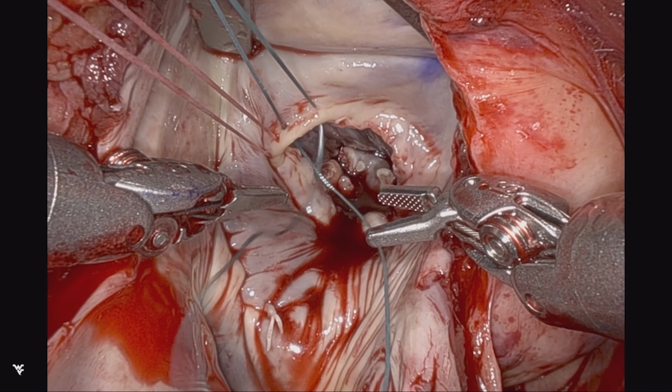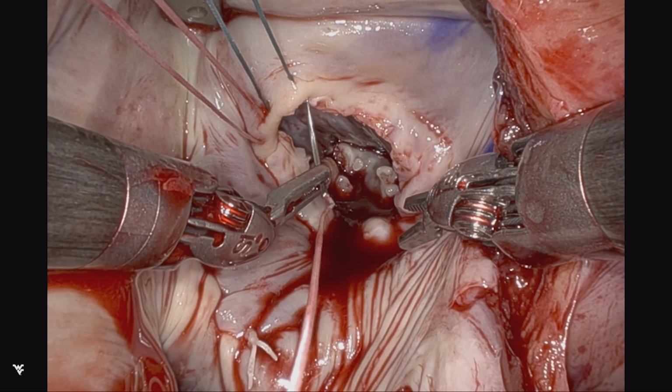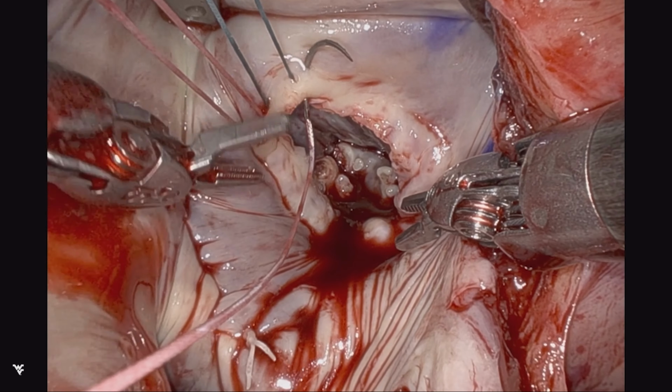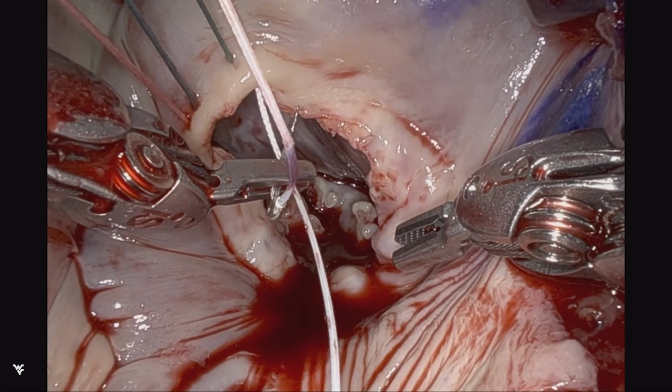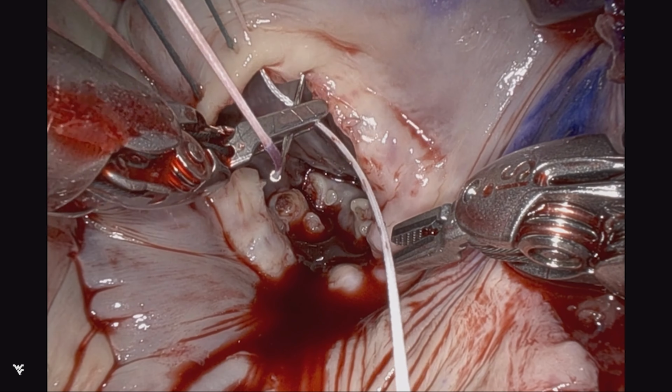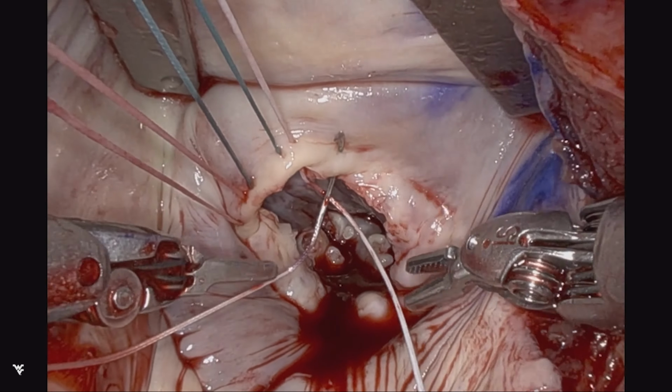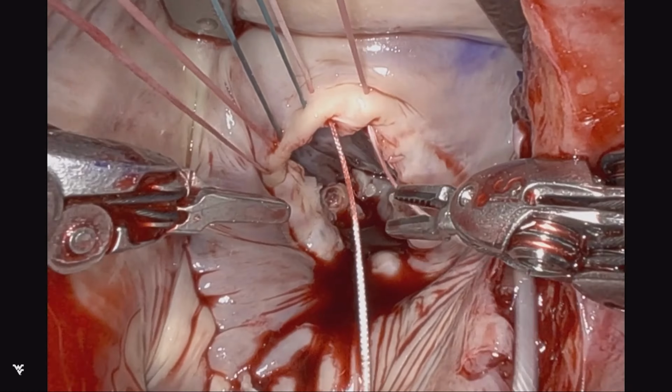Again, as shown in the previous case, I'll fold the anterior leaflet over on itself to create its own autopledget. This is important, particularly in this anterior suture line, because it's usually less robust than the posterior.